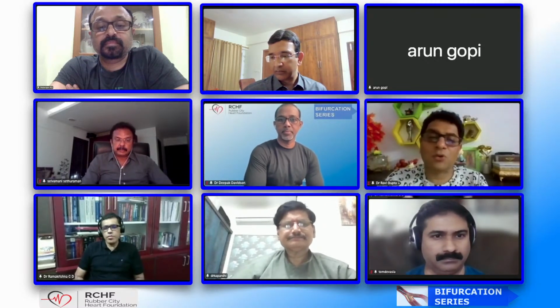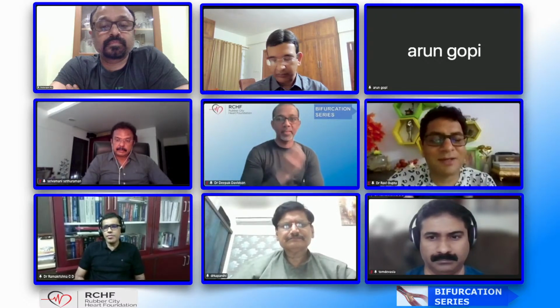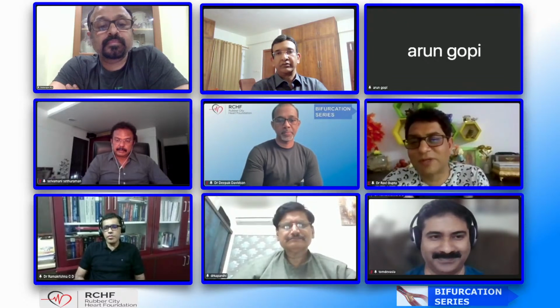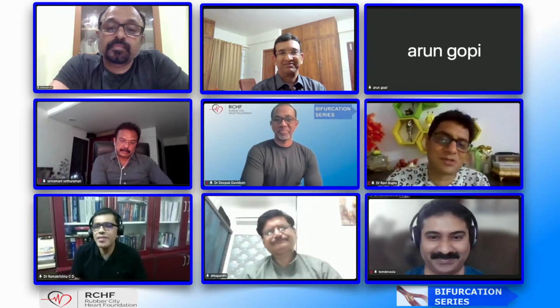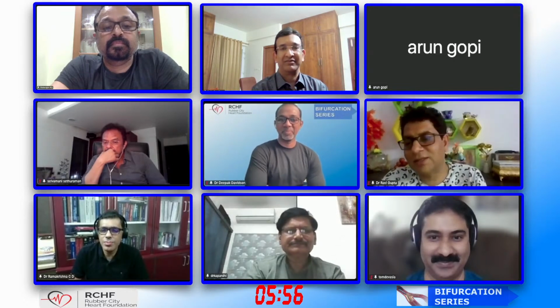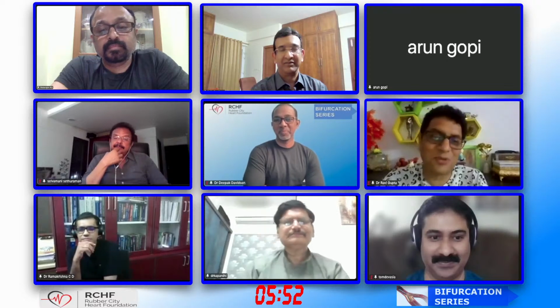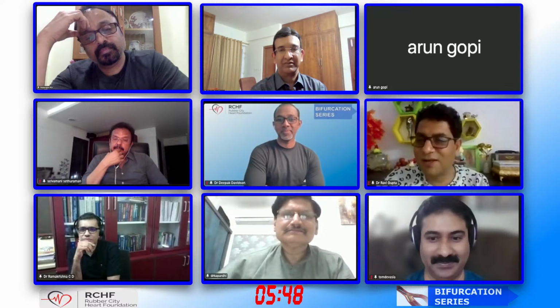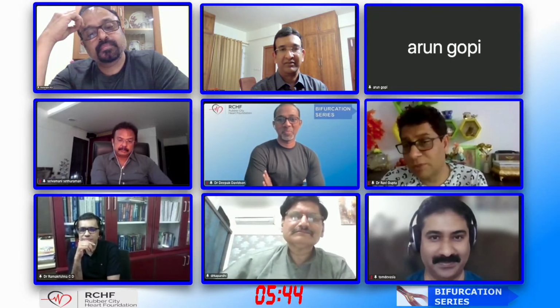I don't know why people don't like, in the bifurcation club, the mini crush. We are very much comfortable with mini crush. I've been doing a lot of cases with mini crush, with reverse crush, and I would say that this is a very, very handy step. When you are limited with your hardware, I mean repeated balloons, repeated wiring, in those situations, mini crush and reverse crush is a very, very good and handy technique with good long-term results.